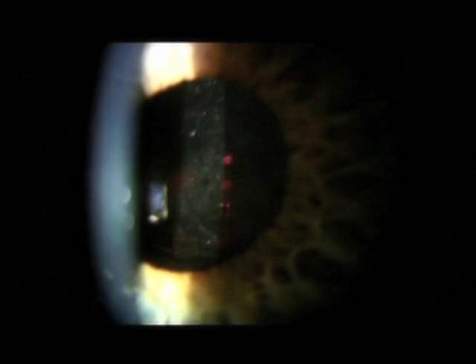Next we'll see a video with the actual laser room sounds of me talking during the laser procedure. You can see it's the view in, which is probably very similar to what the patient's view out is. The laser has these little red light aiming beams that come together and help us focus the laser exactly on the part of the capsule we're trying to treat.